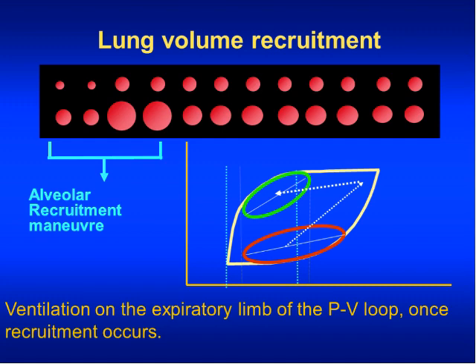But anyways, we start on the left hand of that row of pink dots with a fairly collapsed lung, and we have to go through some sort of recruitment maneuver. This same state is shown with that red oval on the inspiratory limb of the pressure-volume relationship, and you can see that the compliance is poor. That's a diagonal line.